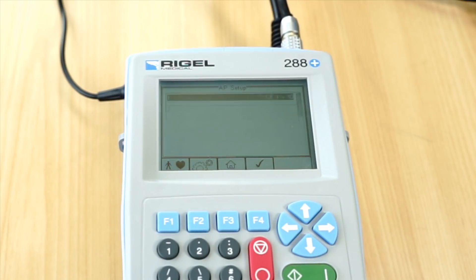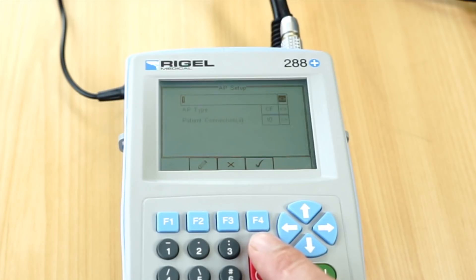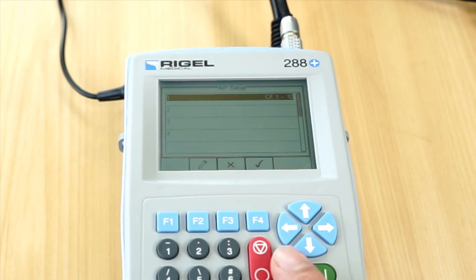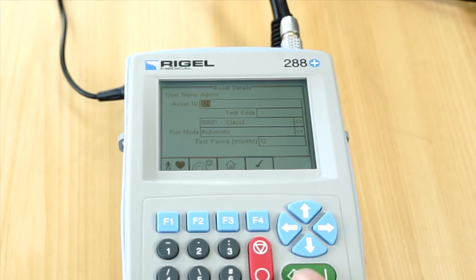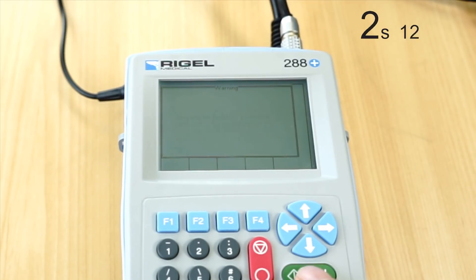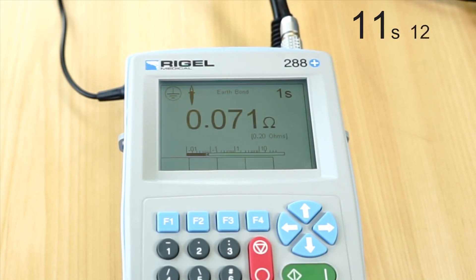Then we are going to press F1 to highlight the 10 CF connections. Once we are satisfied with the asset details and the test setup we will press F4. The first test in the sequence will be an earth bond test, and we will follow the on-screen prompts on the 288 Plus device.